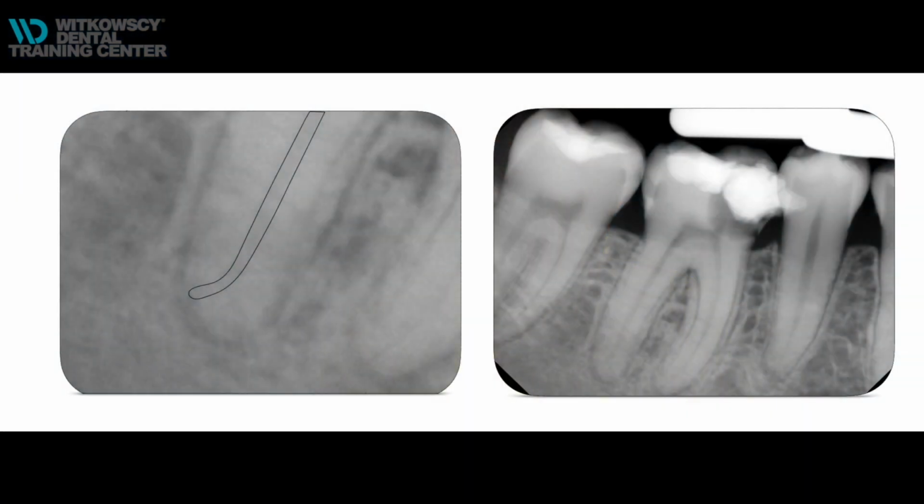When we come back to the original X-ray before the treatment, you can see that the original canal was in that manner. The problem that I encountered at the apical zone was that I reached almost the apical zone and I tried to go into the apical area. Unfortunately, I was not advancing. So what I did, I pushed the file, and that was my biggest mistake. Because when I pushed, the file went in the wrong direction and created a wrong path.